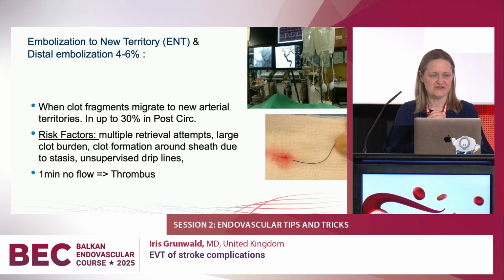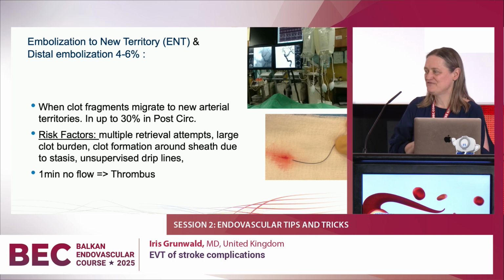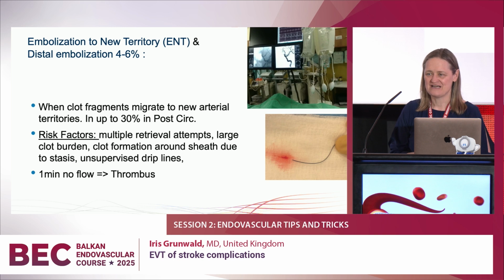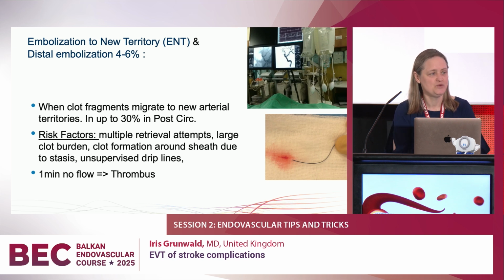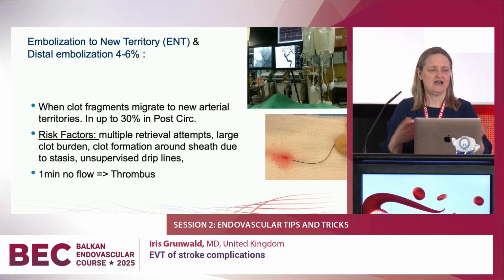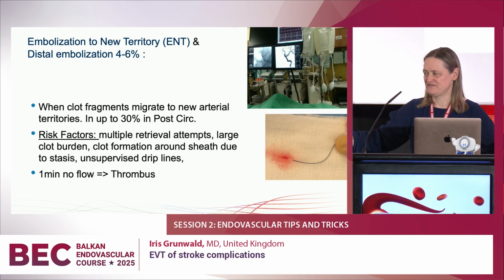And that is something which is very different in neuroradiology to radiology and cardiology procedures, because I bet that many of you do not work with flushes, with those pressure bags, for every single catheter. That is one of the main differences in neuroradiology. With those tiny catheters, we see that it takes only 1 minute for them to be blocked, and as you see here, there's then clot inside, and you unknowingly push the stent retriever through it, and suddenly you have got the whole 1 meter 80 of thrombus pushed inside of the brain.